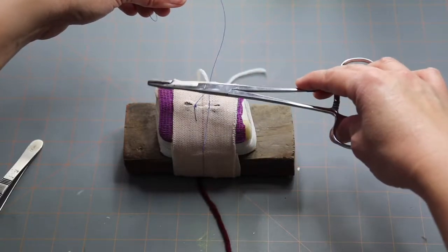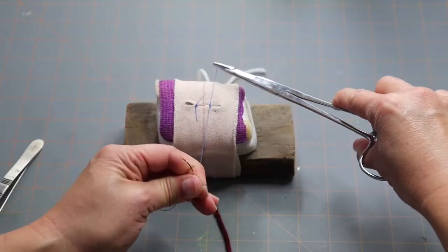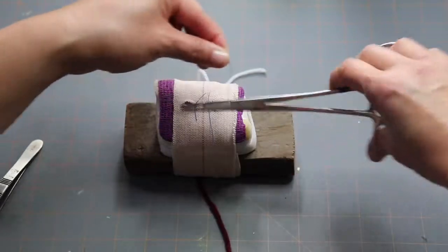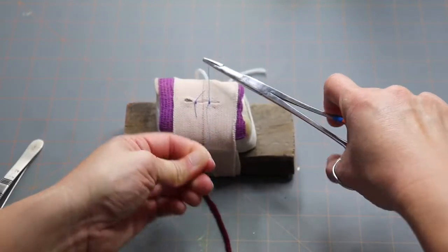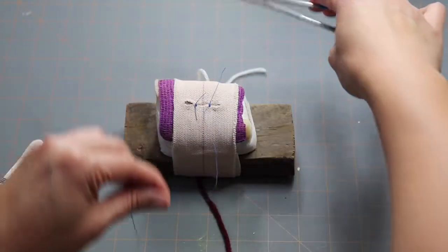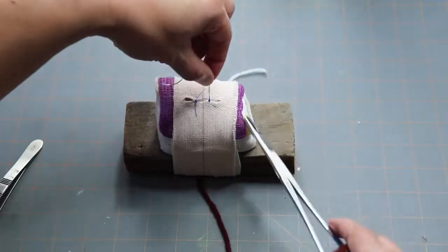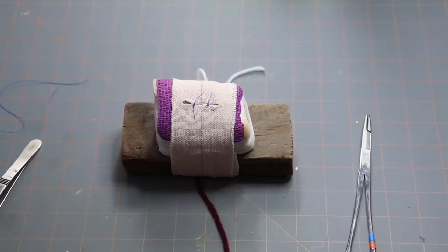Throw number two: needle holder in the middle, wrap your suture around, grab the edge, pull through. Number three: wrap it around, grab your edge, pull through. Last one: wrap around, grab your edge, pull through. You can see the pattern — your hands just go back and forth, tying the knot. If your left hand is close to you after tying, it needs to be on the other side next time, and vice versa. Now cut the edges — grab both ends of your suture and go ahead and cut it. And there you have two simple interrupted sutures.